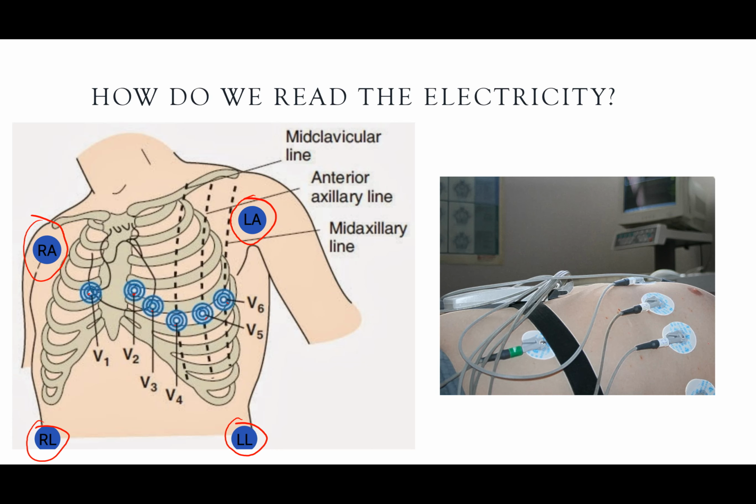make sure is on the right side of the sternum at about the 4th intercostal space, and V2 just on the left. And then you want to get this midclavicular line for your V4 and kind of go between the 5th and 6th ribs there, or around the nipple line. And then in between you can put V3, and then V5 and V6 will kind of wrap around the lateral side of the left chest.